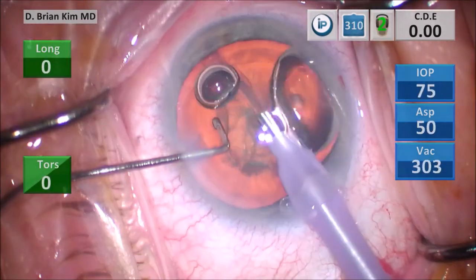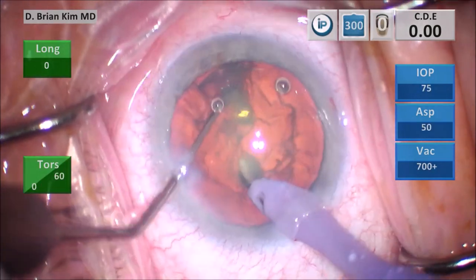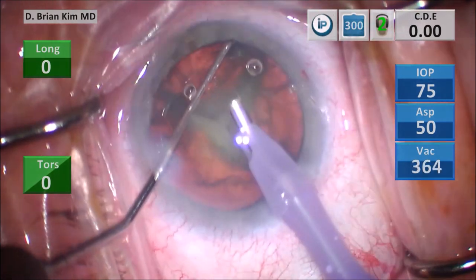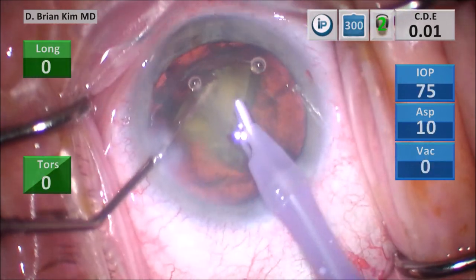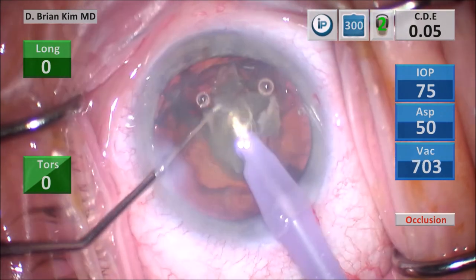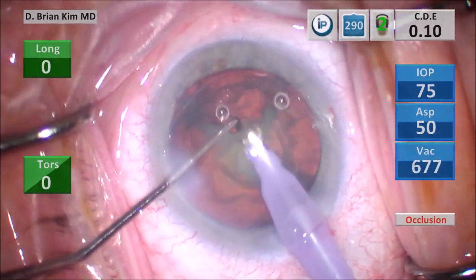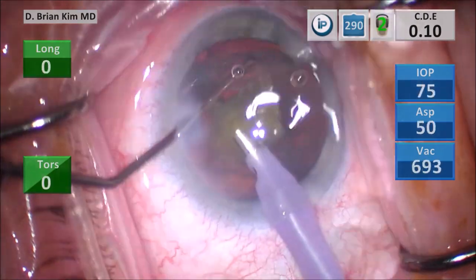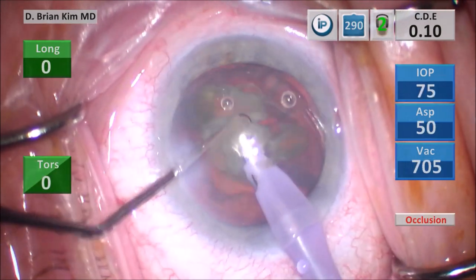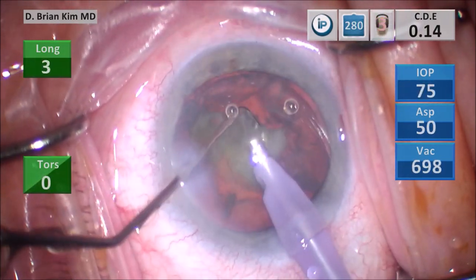Now I'm going to go ahead and start the phaco. I lift my wound with my chopper and then go in with the phaco tip and start irrigation. I perform the double chop maneuver, placing the chopper out to the equator and placing the phaco tip more vertically sub-incisionally, crushing the lens material between my chopper and phaco tip. The chopping is going very easily and nicely. I'm using a limited amount of ultrasonic energy and a significant amount of vacuum to aspirate the lens material, using the chopper to prolapse lens material into the central safe zone and crushing as I go — pulsing in between, then crushing and sandwiching the lens pieces until they are bite-sized, then emulsifying.